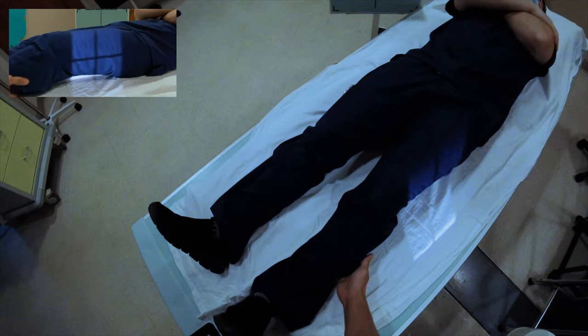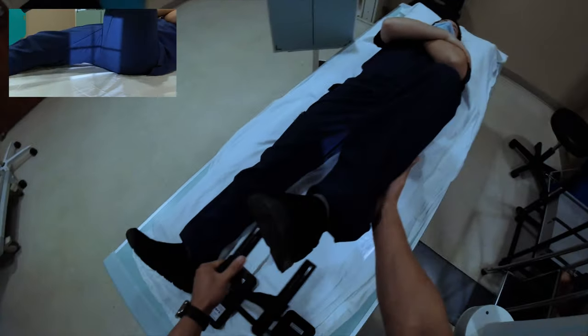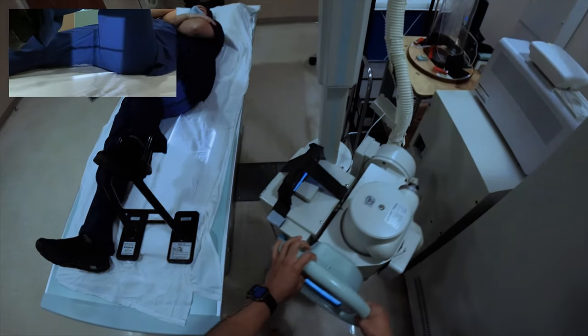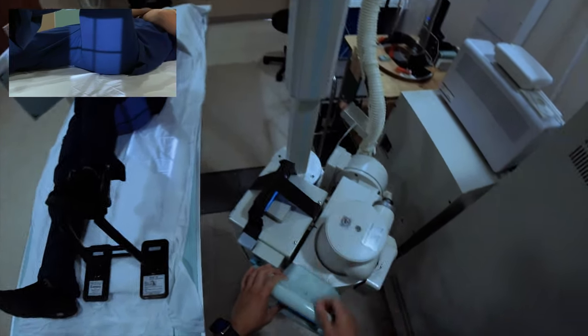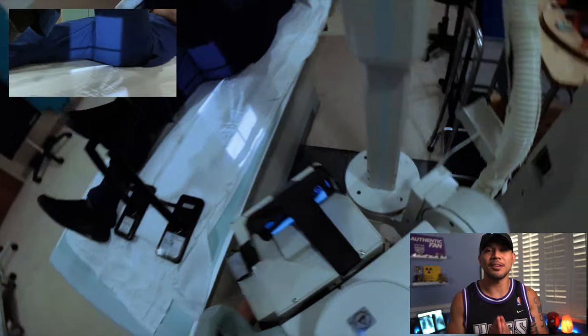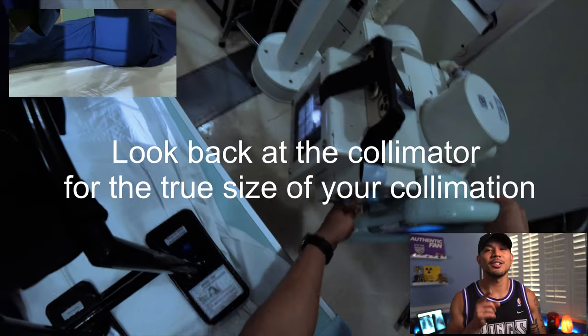We're gonna bend your left knee towards your chest. So bring this up, and then we're gonna put your foot on this holder here. Bring it up more if you can. Is that all right there? Yeah. All right, hold that still there for me. Just aim for the crotch. Nine times out of ten, you are on the dot.